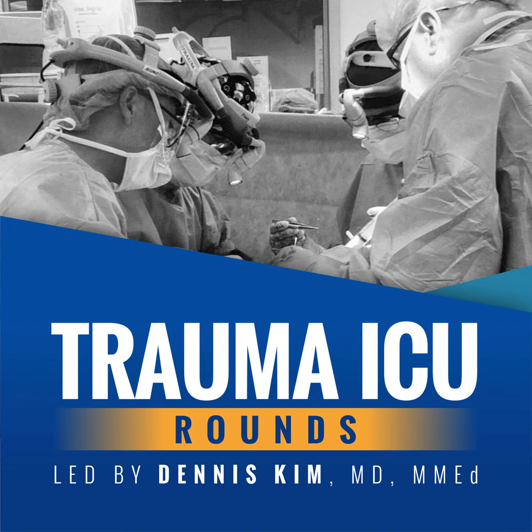After the breath is delivered, patients can once again breathe spontaneously without receiving another mandatory breath until the next one is scheduled to be delivered. So when would we employ SIMV? Well, in general, this choice of mode is used when we're looking to provide patients with partial ventilatory support. So earlier, we discussed the patient in the throes of shock with a pH of 6.9 who's critically unstable that we just placed on the vent.